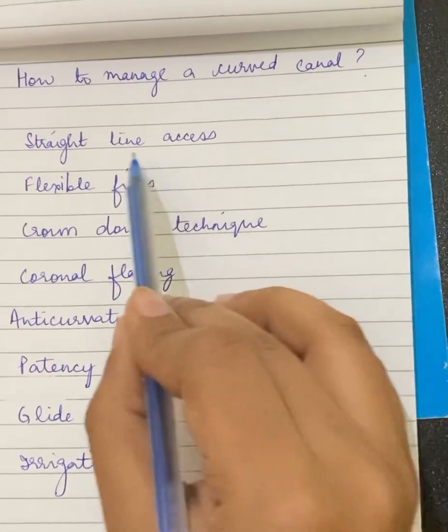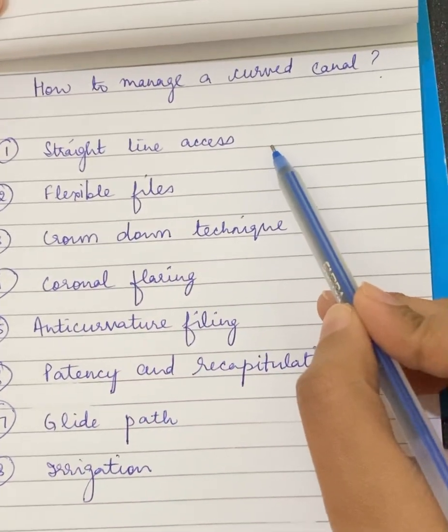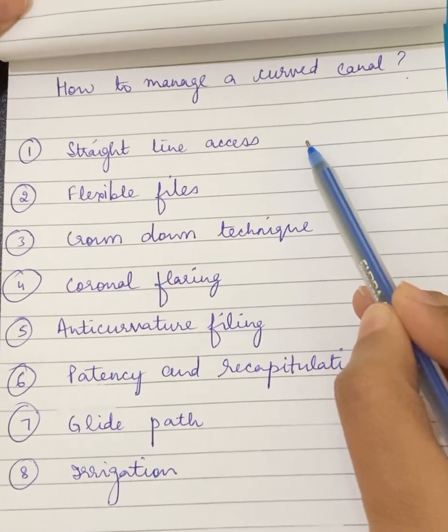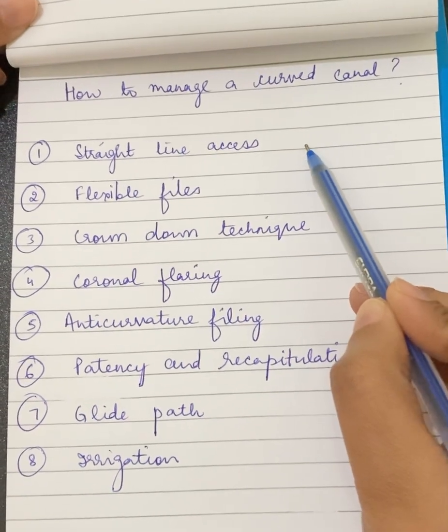First is the access cavity preparation. You should always have a straight line access to the canal. Once you have a straight line access, the bending of the files is avoided, so any kind of instrument fracture will be avoided.